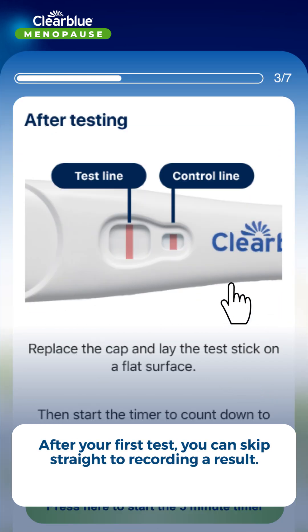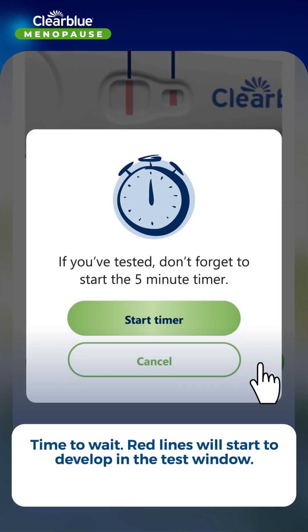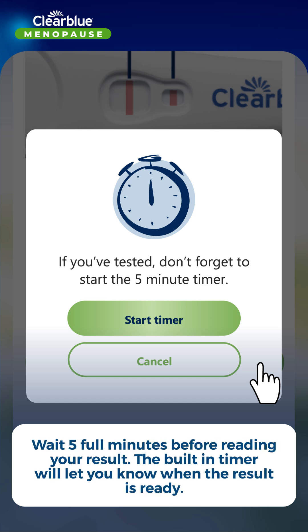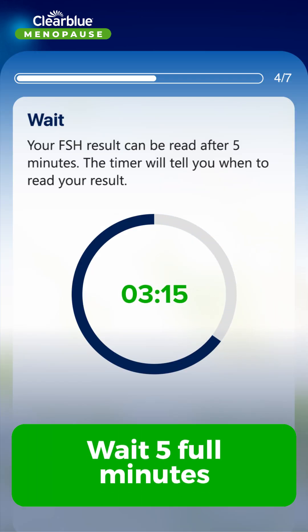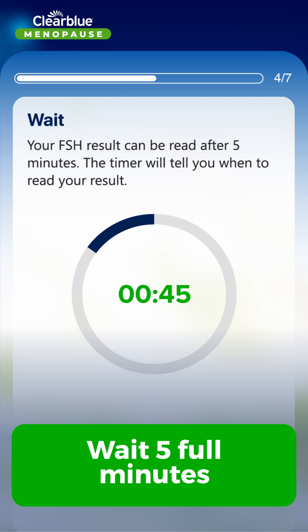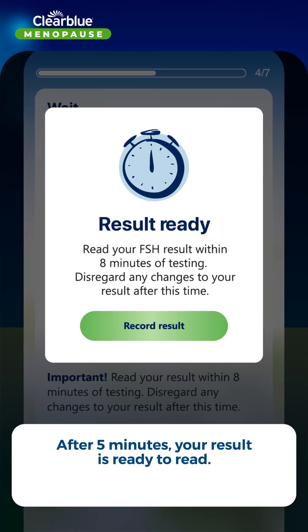After your first test, you can skip straight to recording a result. Red lines will start to develop in the test window — wait five full minutes before reading your result. The built-in timer will let you know when the result is ready. After five minutes, your result is ready to read.